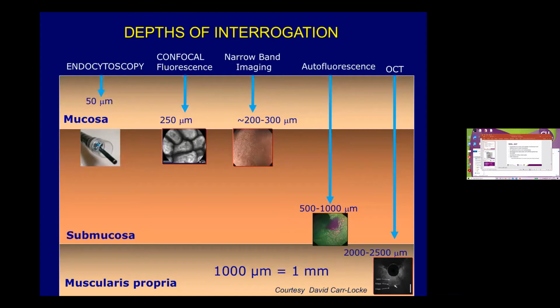Not only are we going to use this enhanced image endoscope, and some of this again is available, endocytoscopy, where you can see to a depth of 50 microns, confocal fluorescence microscopy, deeper, 250 microns, and of course autofluorescence, which guesses a lesion, which is actually more like a screening method to tell us whether there is a malignant lesion or not, and of course OCT. All these are going to come in now, and I think these are going to be added to a standard endoscope. Again, this may not be immediately, may not be tomorrow, but certainly they are going to come fast.